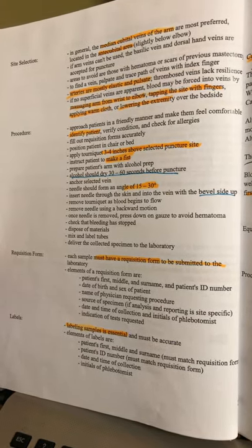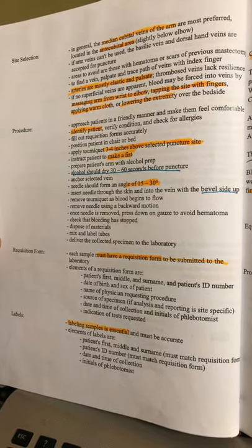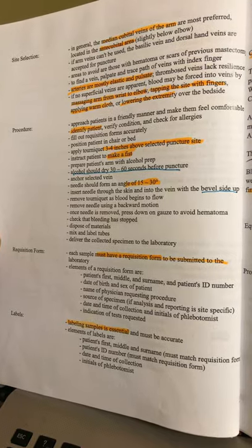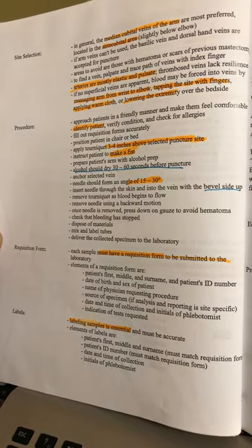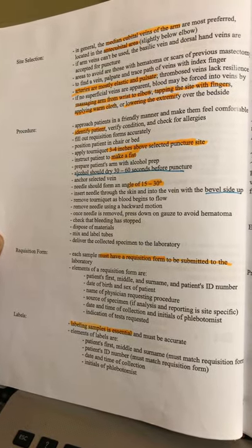Once you start seeing blood flow, you remove your tourniquet, then remove your needle. Once the needle is removed, press down on the gauze to avoid hematoma. Remove your needle and put gauze on it. Check that bleeding is stopped.